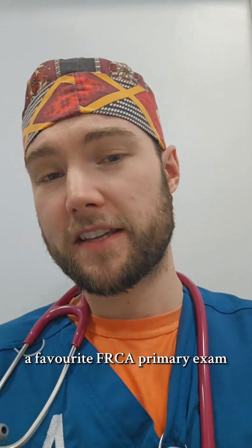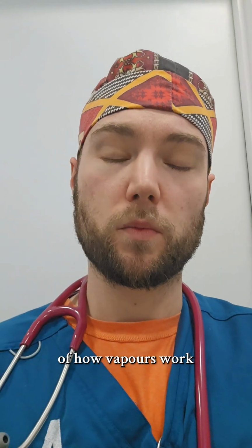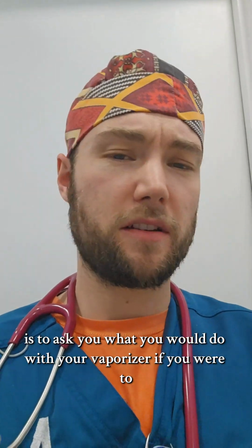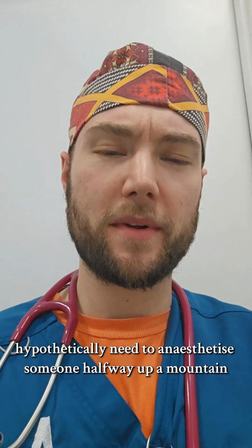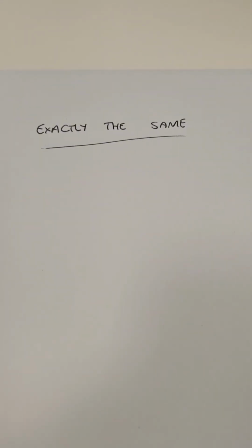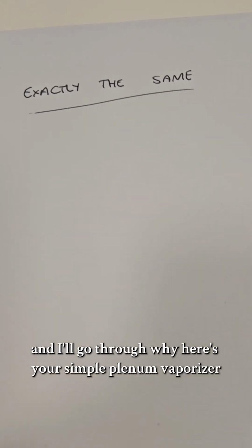A favourite FRCA primary exam question, testing your understanding of the physics of how vapours work, is to ask what you would do with your vaporizer if you were to hypothetically anaesthetise someone halfway up a mountain, where atmospheric pressure is half of that of sea level. And the answer is exactly the same as you would normally. You don't have to change anything, and I'll go through why.